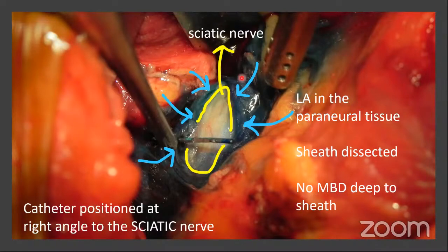And this is the paraneural tissue. What Shailesh was talking about is the paraneural tissue, or what has been demonstrated by several articles by Manoj Karmakar. And he mentions the paraneural tissue. And this is the paraneural tissue which stains the whole with the methylene blue dye.